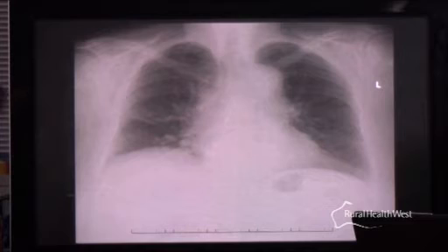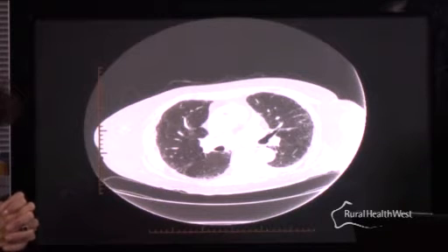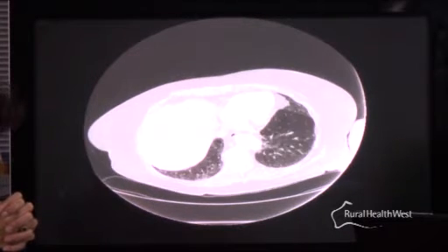You can't take it any further on the chest X-ray, but you would be suggesting that someone who's got this appearance on a chest X-ray requires a CT to take it further. And that was proceeded to. I'll just run through a few images of the CT before I start, so that everyone can have a look at what we're looking at.